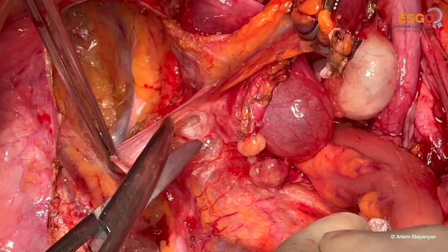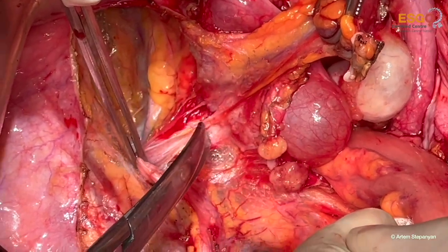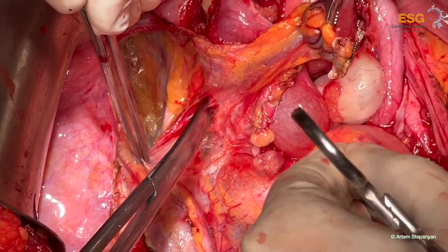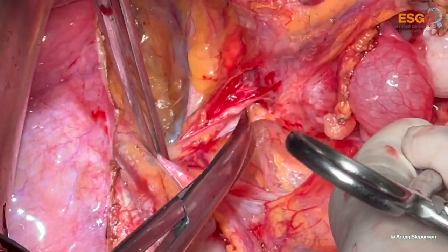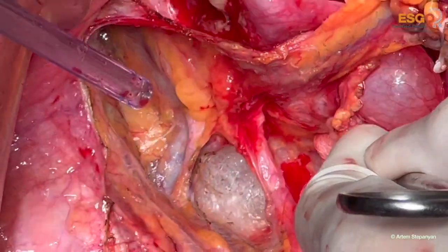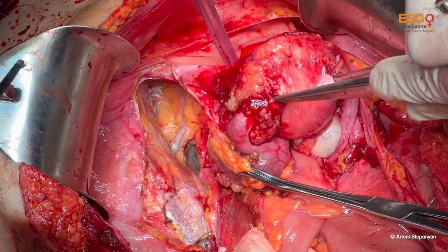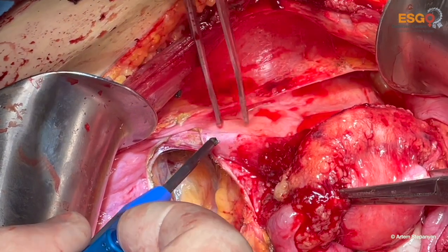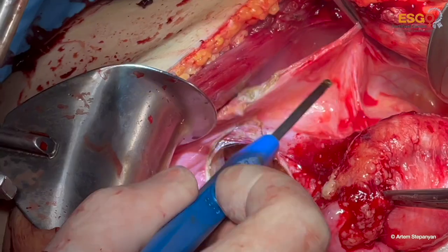It is important to mobilize the ureter and mesoureter from the peritoneum, from the posterior leaf of the broad ligament of the uterus, because it's a part of Douglas's pouch, and we will remove it. This is the peritoneum of the bladder.